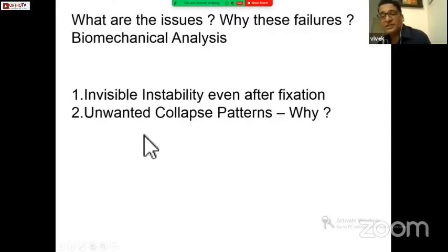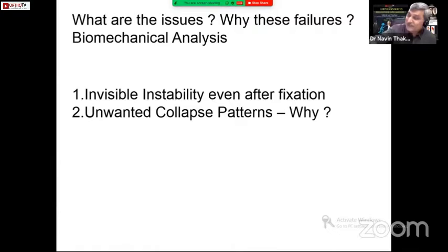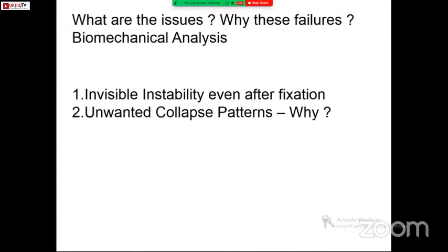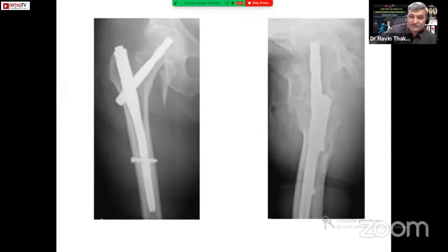Will lateral wall fixation make a difference in this case? Yes, it is a normal lateral wall. No, it is breached by the larger size of the implant. It is an intraoperative breach, like a DHS. And if you go back in the X-ray, you can see the lateral wall is separated out. Can you go back one? Yes. Just one back.